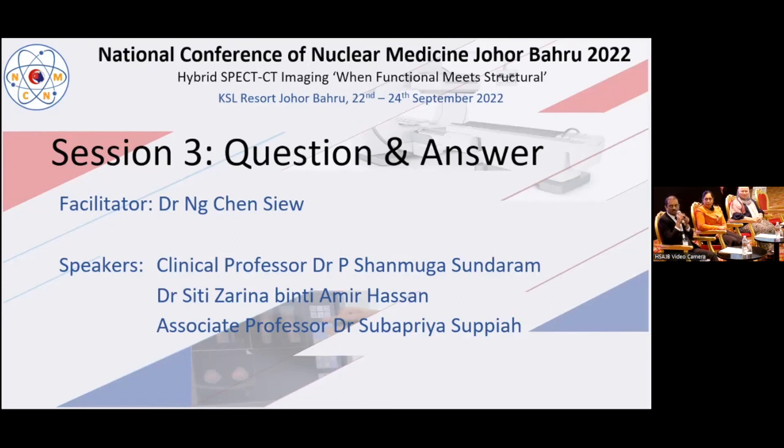Deauville score is a must, because today medical oncologists not only depend on your SUV values and your findings, he looks for the Deauville score. If there is a reduction in the score by 1 or 2, then his aggressiveness in the therapy management also changes. So always use Deauville score in the lymphoma follow-up. And for your question, yes, definitely not really necessary to do a contrast CT every time, especially in lymphomas.